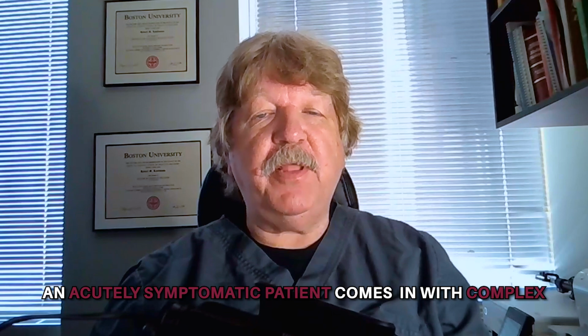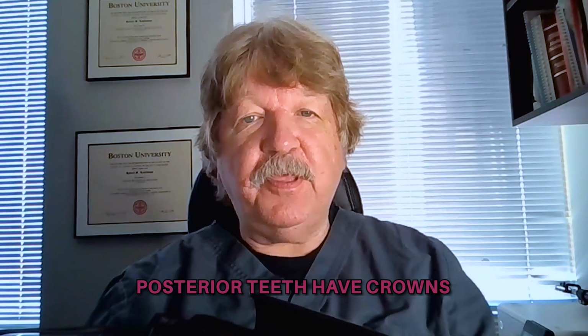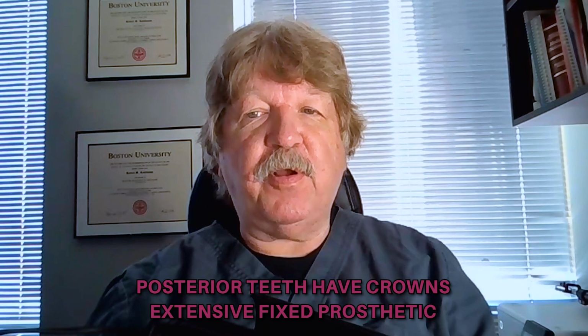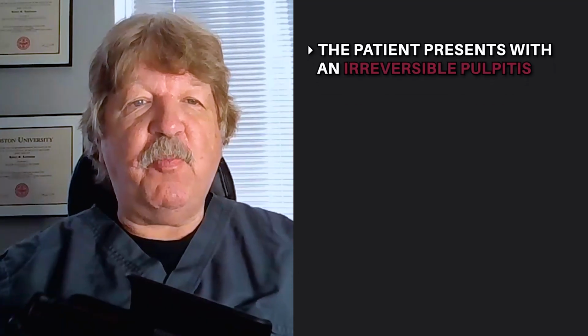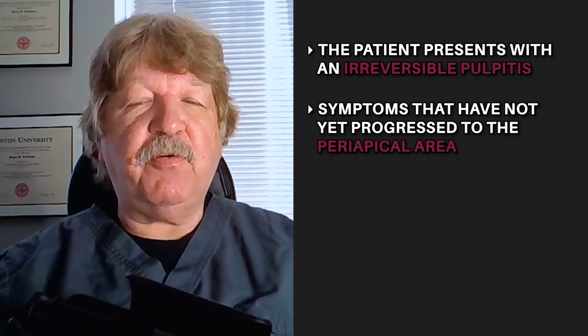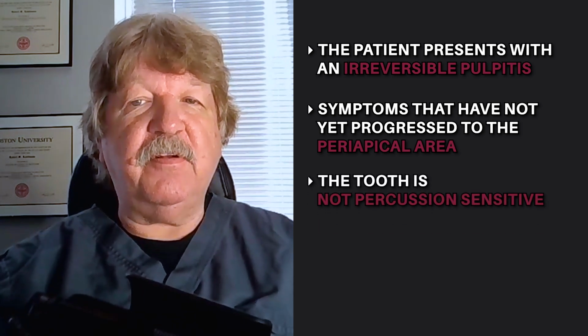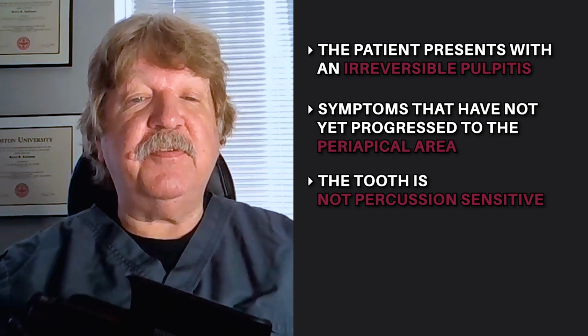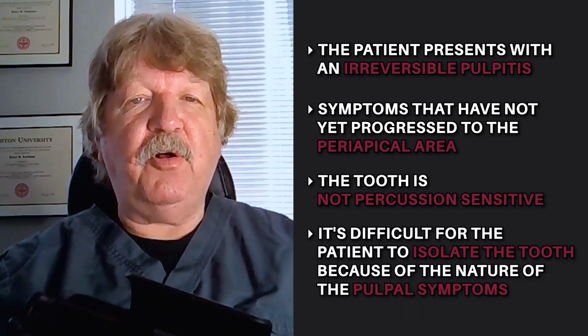We've all been there. An acutely symptomatic patient comes in with a complex restorative treatment that makes diagnosis difficult. Sometimes all the posterior teeth have crowns or an extensive fixed prosthetic. Radiographs may show an entire side of radio-opaque crowns that are not much help in diagnosis. The patient presents with an irreversible pulpitis and symptoms that have not yet progressed to the periapical area. Because of this, the tooth is not percussion sensitive, and although they're in a great deal of discomfort, it's difficult for them to isolate the tooth because of the nature of the pulpal symptoms.